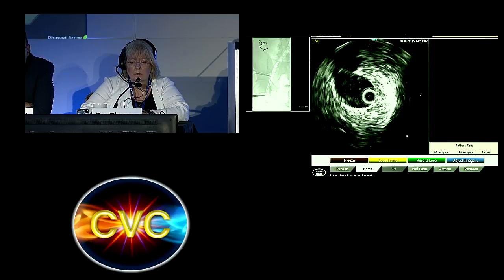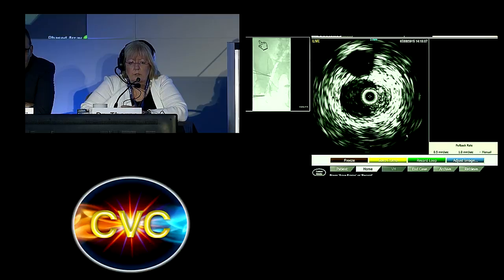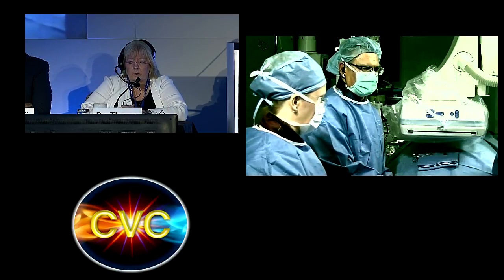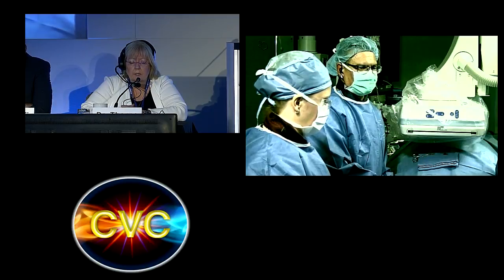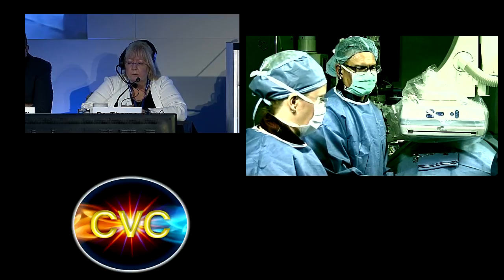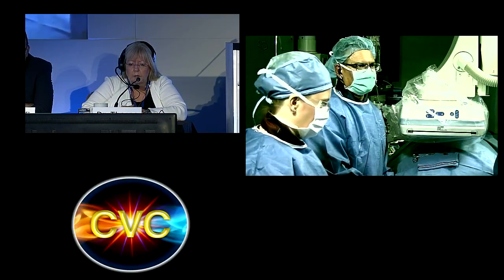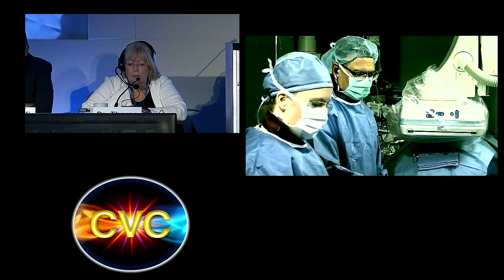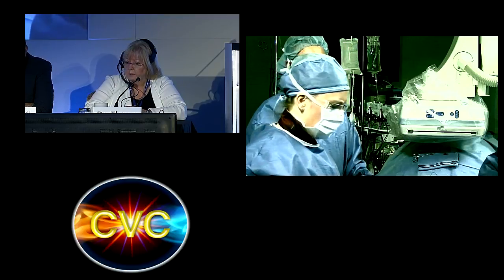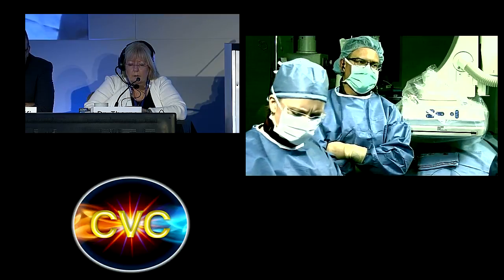So is that selection of stent proper in your opinion? Well, I'd use a longer one myself, Julio. Okay, what would you use here? Because if it continues to expand, it'll foreshorten, and then it'll be up right at the common femoral, right close to the inguinal ligament. I don't think you'll have any harm by going a little lower. What do you think? Yeah, I think at least an 80 millimeter, at least 80. An 80? Yeah, then the nitinol stents are also an option too.